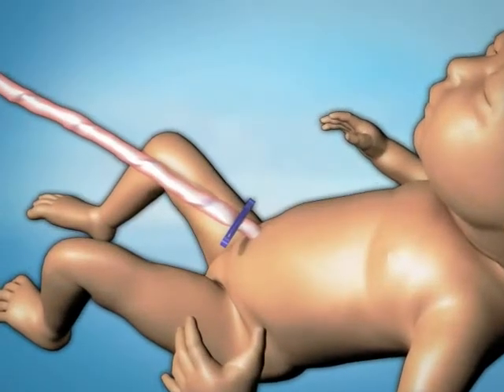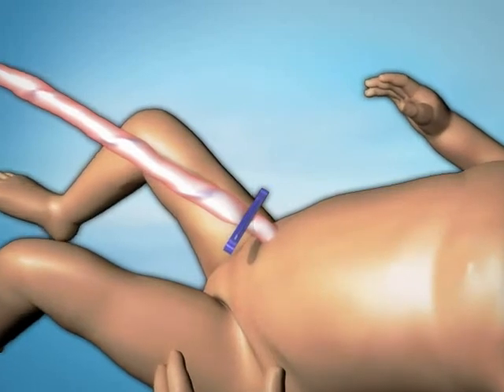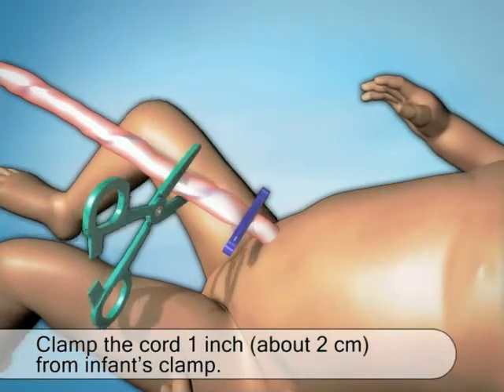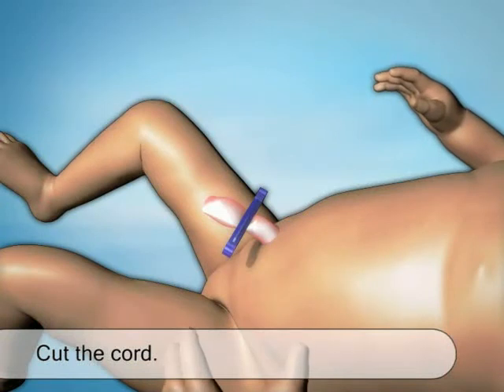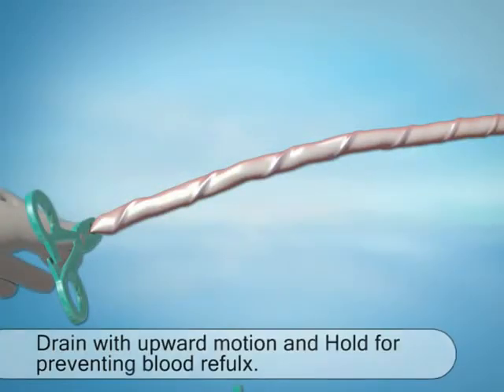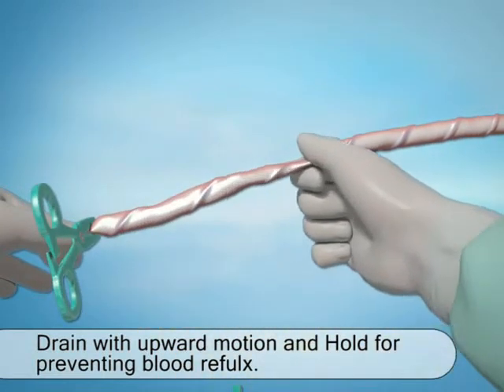Following birth and immediately after clamping the cord on the infant side, place the green clamps one inch — that's about two centimeters — apart, and clamp the cord. Cut the cord between the two clamps using the scissors. Now hold the bottom end of the cord and drain the blood towards the placenta by milking it upwards about six inches or 15 centimeters.